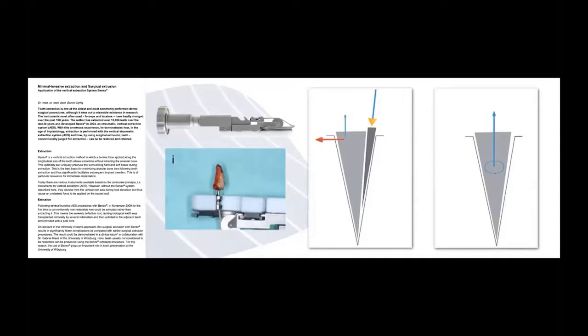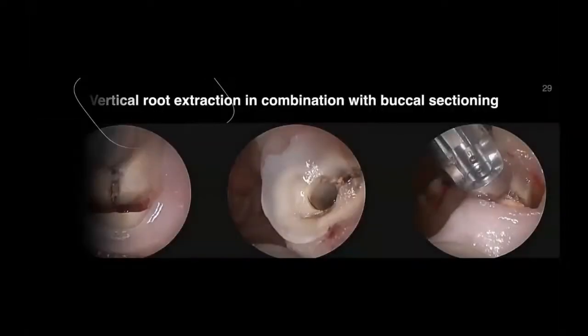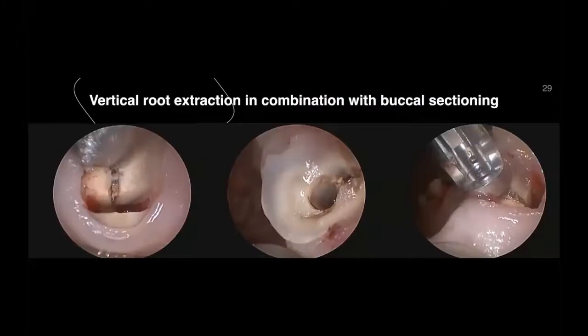Okay, here I wanted to share with you the clinical sequence step by step of a minimally invasive vertical tooth extraction in the 2.4 position.